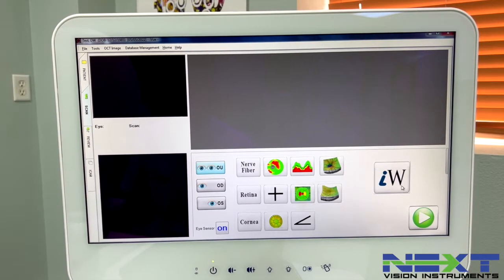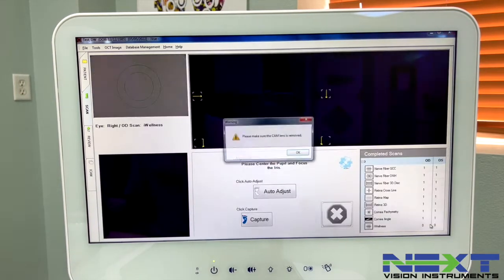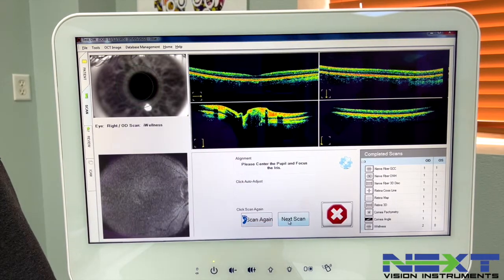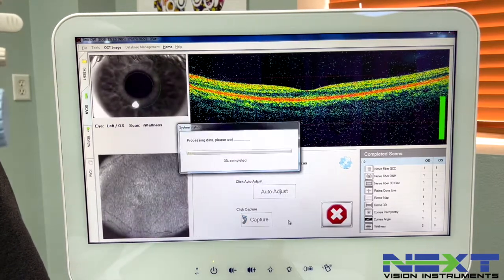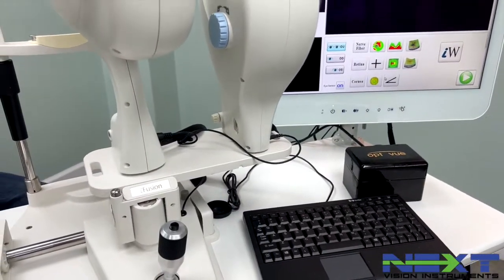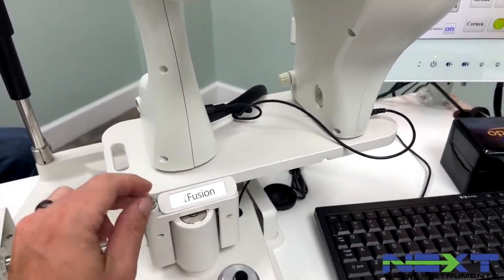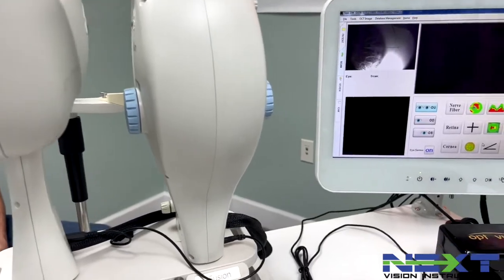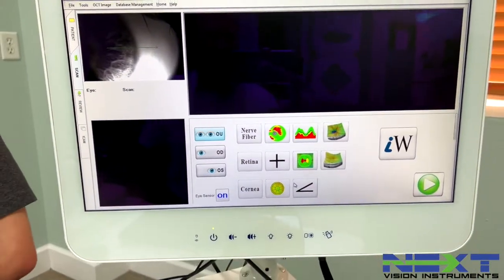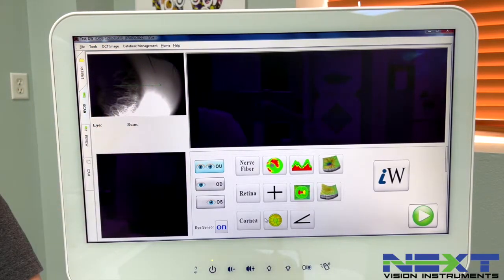After completing the OCT scans, we're going to switch to the iCam. The iFusion has a release button — click the iCam into place. In the software, you already have the patient pulled up. Go over to the tabs and click iCam, then go to your patients list, click Show All, select the patient we just had, and at the bottom go to Capture.